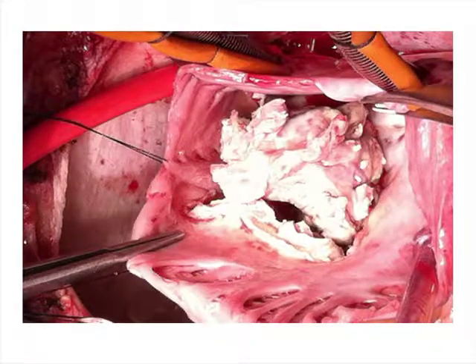This is the gross image in situ of the tricuspid valve vegetation at the time of surgery. It is easy to appreciate how large and destructive this lesion was. The entire valve was excised and the patient received a tricuspid valve replacement.